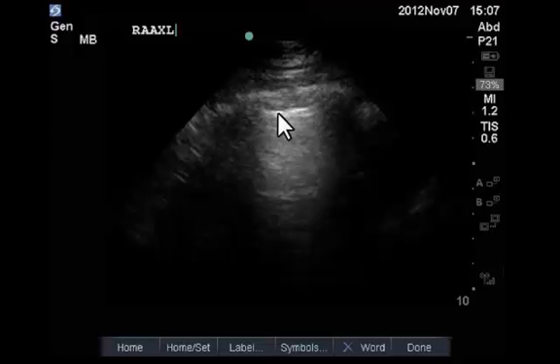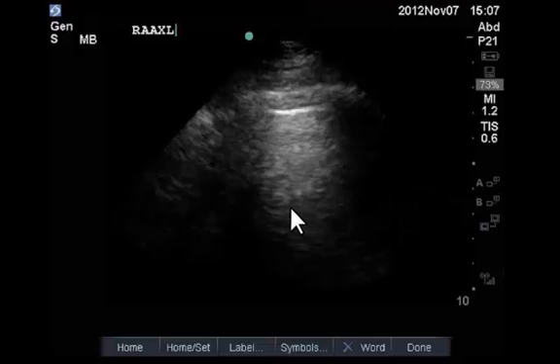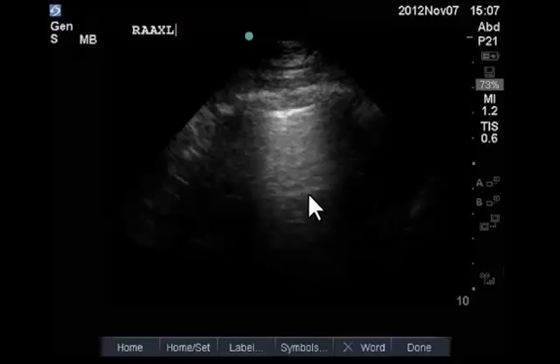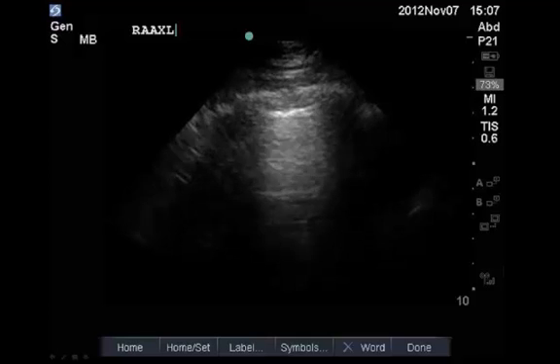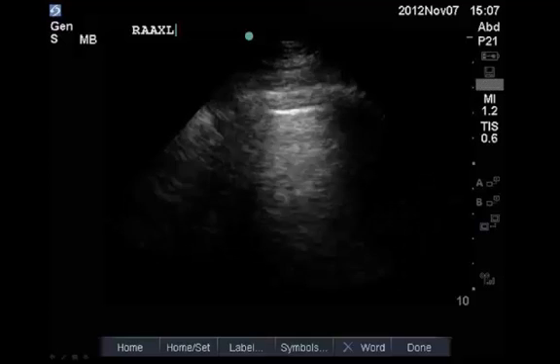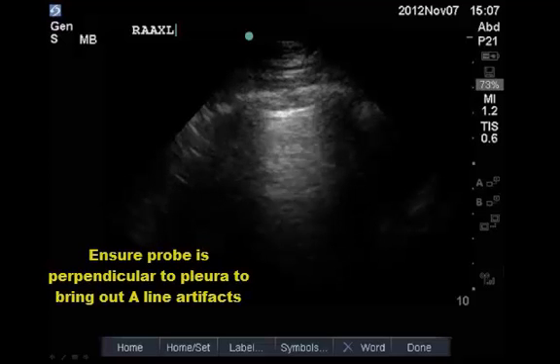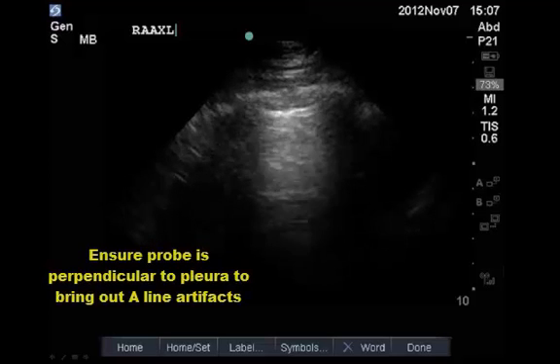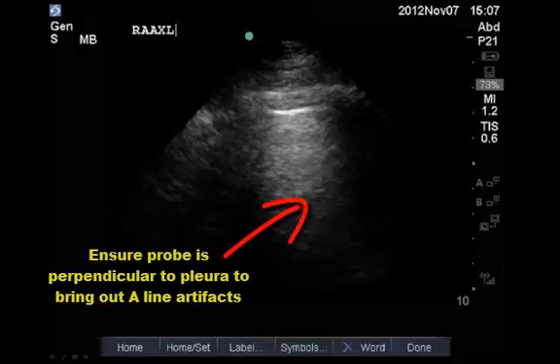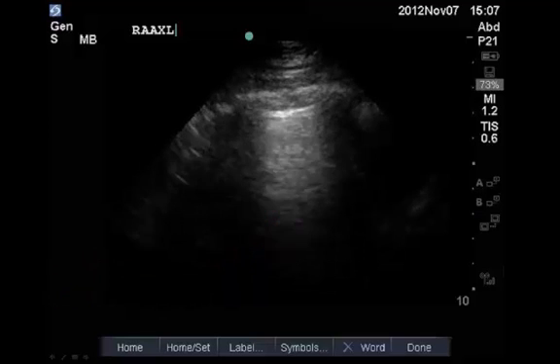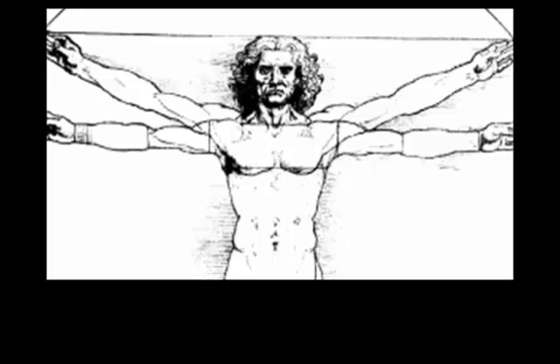We see the rib shadows again off to the side of the image with the pleural line centered right in the middle. We can see dynamic movement suggesting sliding, and an A-line that comes in and out of view at various intervals. If ever you're not able to bring out A-lines well enough, small adjustments in transducer position to ensure the probe is exactly perpendicular to the pleura should be able to bring out A-lines if indeed they're present. That covers the two lung ultrasound views in the right chest.